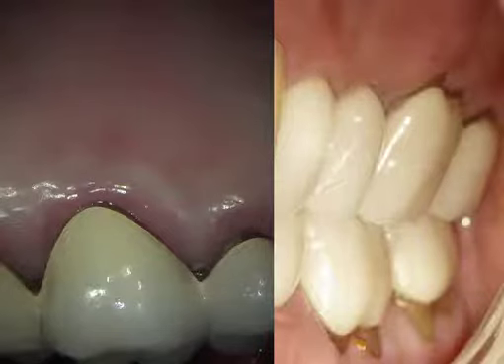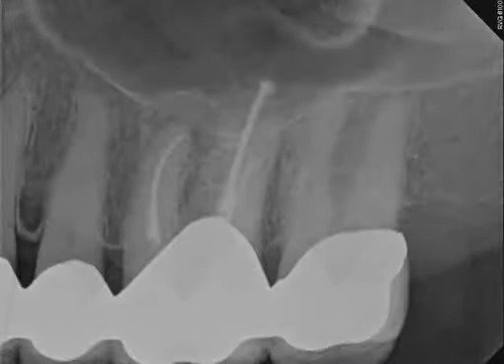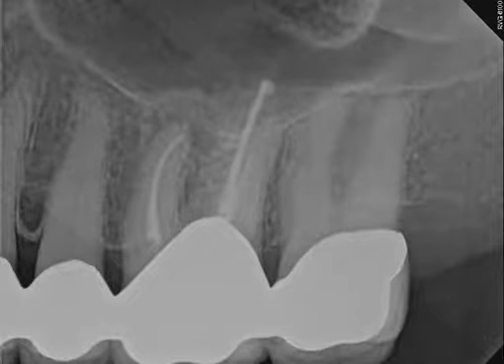This maxillary molar presents with no findings clinically or radiographically. Three separate x-rays taken at three differing angles collectively still didn't yield enough information to obtain a definitive diagnosis.